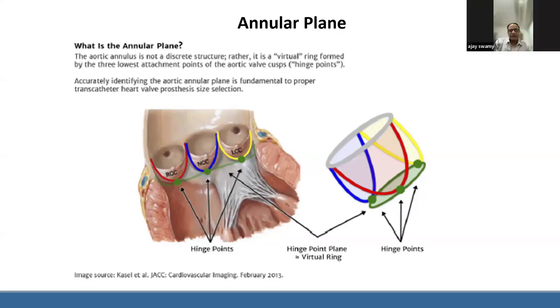Right. So these days, some people recommend that you measure it in both the systolic and diastolic phases. I've heard Vinny Bapat also say that, whichever is larger. But in my limited experience, I didn't find so much of a great difference.